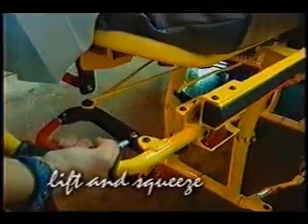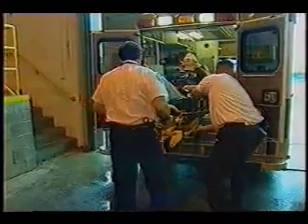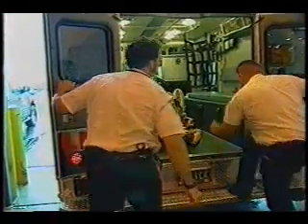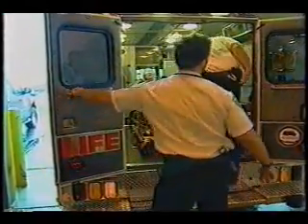Since you're in the highest position, release the auxiliary lock. Then lift the cot to horizontal to help reduce back strain. Squeeze the release handle all the way to the grip while the second operator, using the arm rail for stability and leverage, lifts the legs and helps guide the cot into the ambulance. Engage the cot fastening system and you're ready to go.